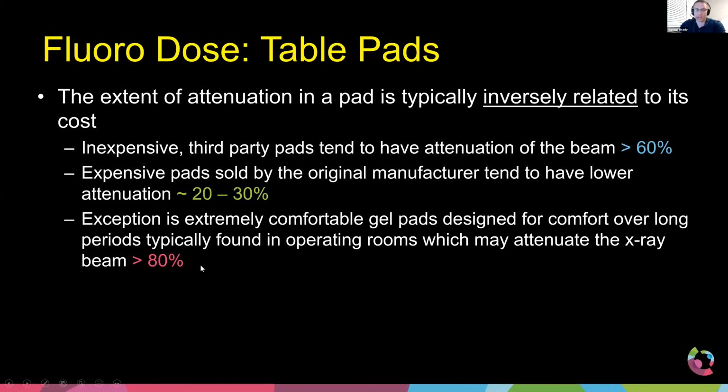And one of the things that, as a medical physicist, I like to do, for example, we've just added a building to our hospital. So we've increased the number of beds we have in our hospital. And the hospital went out and bought all the new hospital beds and all these pads. And of course, they're looking at the most comfortable pads, the pads that hopefully reduce bed sores and all of these things. They didn't think one little bit about radiation.